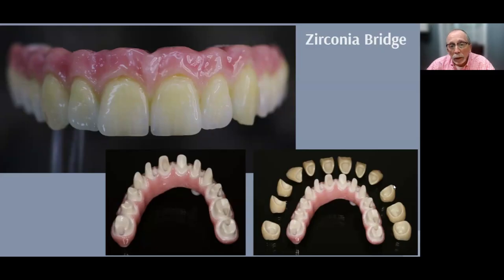I can remember many times designing one of these things in 3 hours, milling it in 3 hours, putting it in the sintering furnace and going home, and not sleeping that night, hoping that when I got in the next morning it was going to fit the model. And sometimes it didn't. It had a rock in it, and at that point, it's start over. Mill it again and sinter it again. So it can be a challenge, and technicians that do this really well had my admiration. It's an awesome skill to have. It's a very difficult thing.